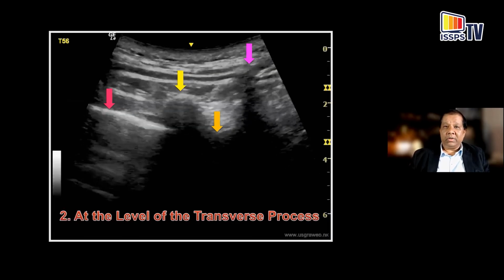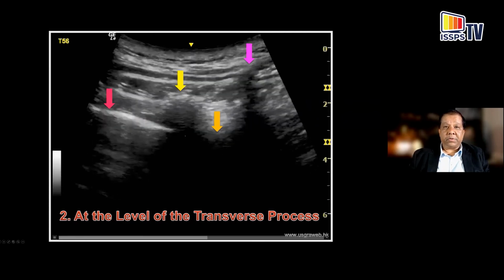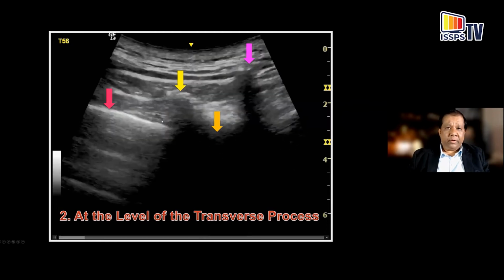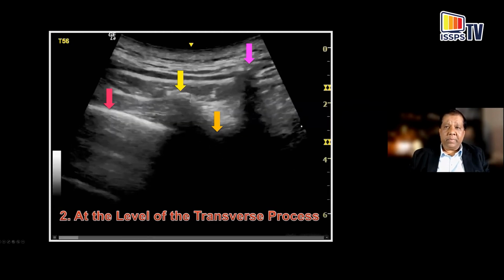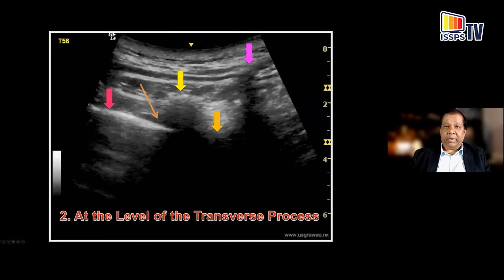You now go below the rib, you will see the transverse process and no shadow laterally, exposing the apex of the paravertebral space, which is the target for the injection that Dr. Shibata and Dr. Nishikawa described in this apical part.